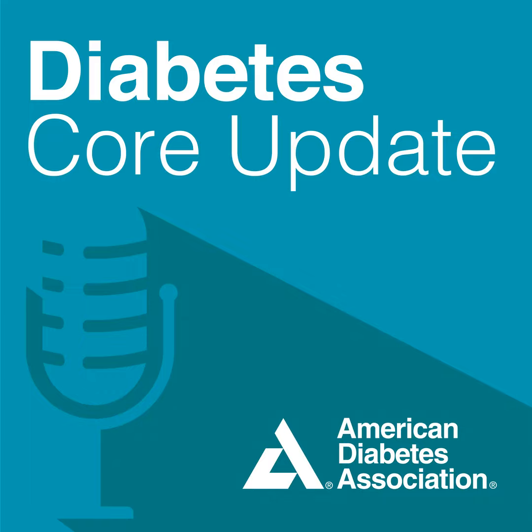Fantastic. Jean, any other challenges that you can think of? I'd just like to pick up on one that Eden mentioned, and that's the one about sensor lag. That's real, and I think you have to emphasize that when the blood glucose is changing very rapidly, so if you see someone, their blood sugar is rising or falling by the trend arrows very rapidly, you really need to have them do a finger stick to confirm what the blood glucose is, because there is this lag, and that lag may be longer when there's a very rapid change in blood glucose. So for low, be sure that you're confirming that.